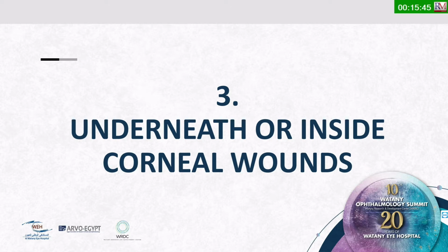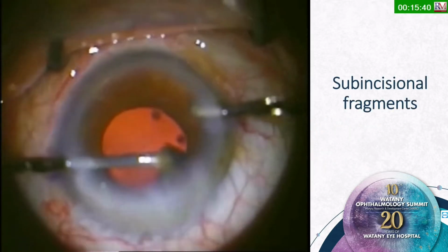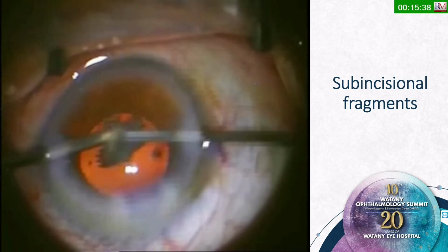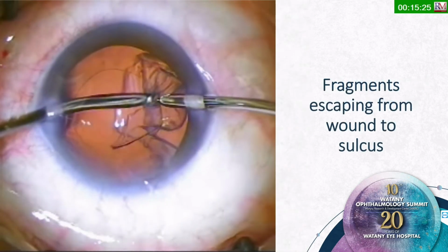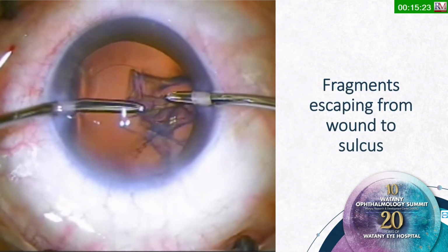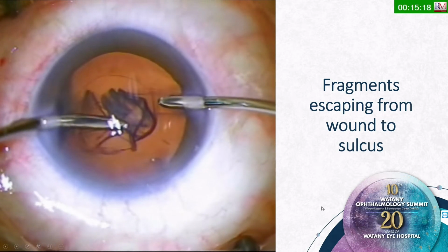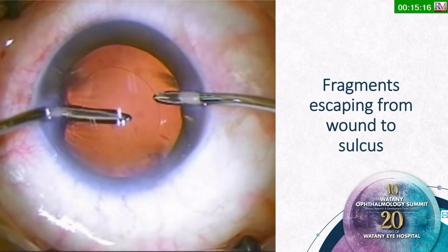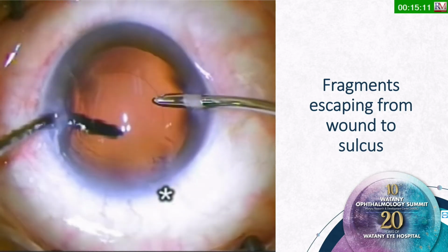Underneath or inside the corneal wounds. Again, this is a favorite place because the corneal wounds are usually hydrated by the time of the surgery, and it is easy for fragments to be hidden there. I always like to wash and look for the microfragments or the big fragments at the area of the hydrated corneal wounds. You can see here there is a small bit of a fragment inside the main corneal wound. If you can see it, the asterisk will show right now where the fragment is.